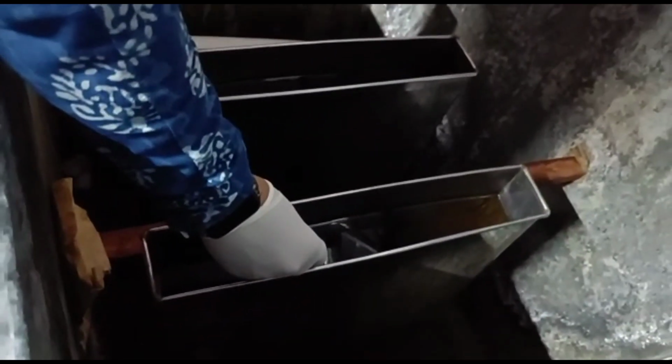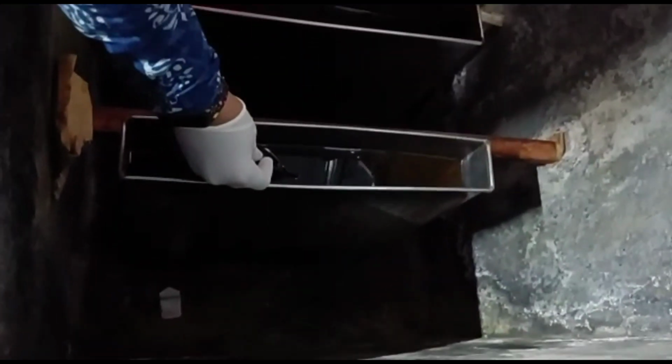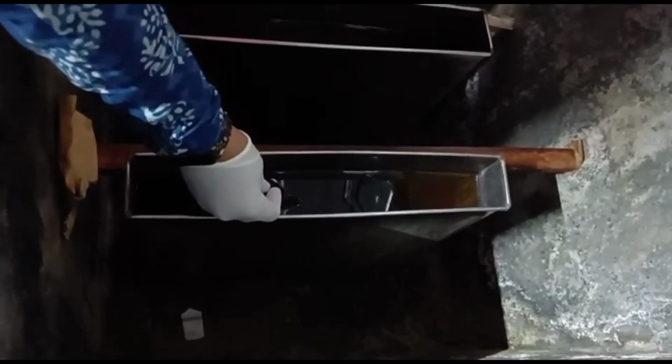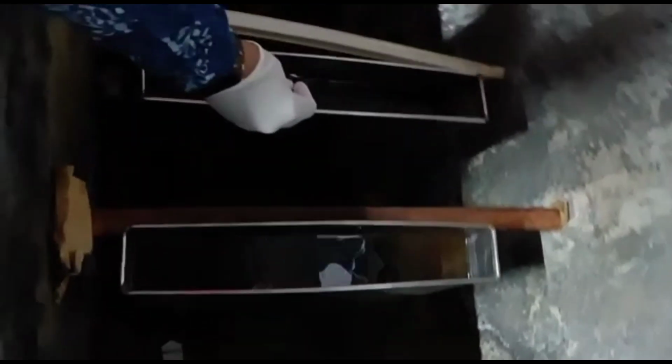The first processing solution is the developer. You develop the image so that you see the varying densities in the GBX red filtered light, wherein you can see that the pulp is darker, a radiolucent structure, and then you have the dentin and the enamel. Next, you move on to the water solution for 30 seconds, and then to the fixer.